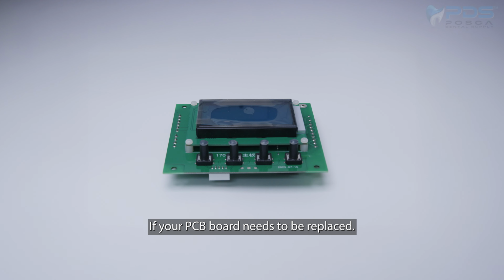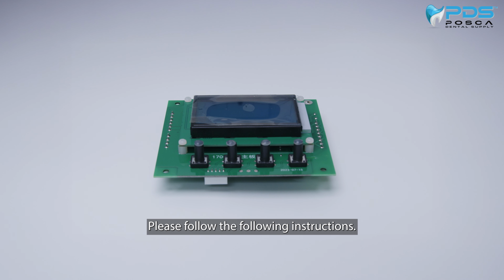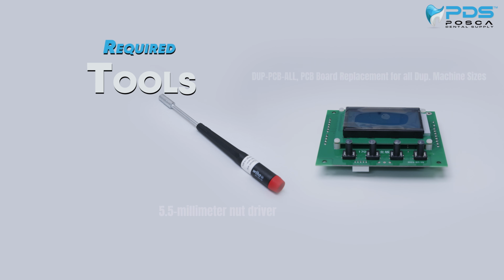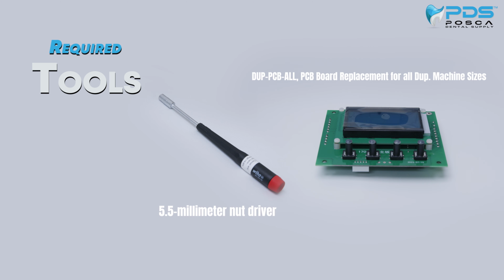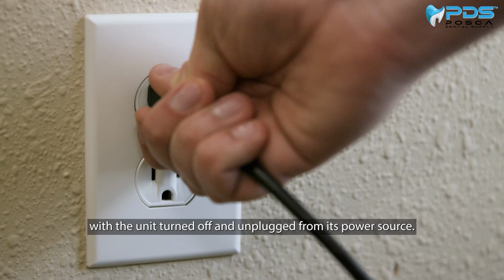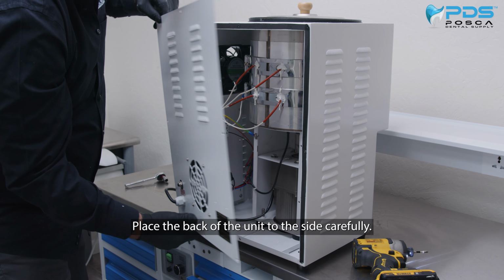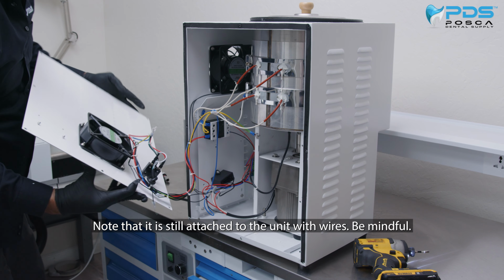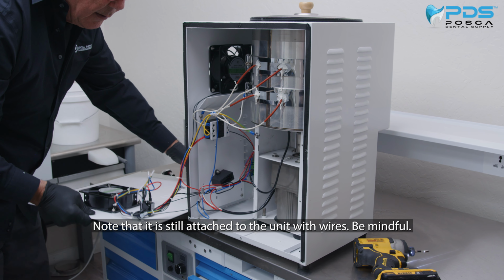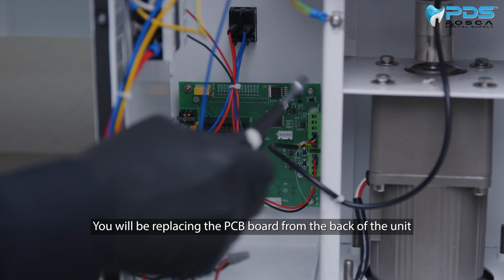If your PCB board needs to be replaced, please follow the following instructions. Before you start, ensure you have the tools and necessary parts. With the unit turned off and unplugged from its power source, remove the back of the unit. Place the back of the unit to the side carefully. Note that it is still attached to the unit with wires. Be mindful. You will be replacing the PCB board from the back of the unit.